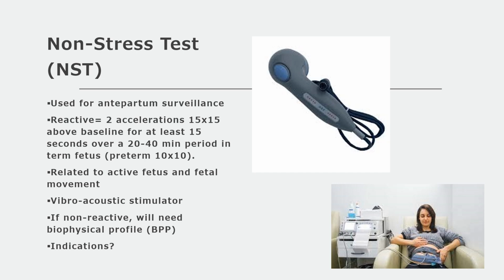Okay, this is an ultrasound test that measures amniotic fluid index, heart rate, breathing, gross body movement, and fine body movement. So there's 5 criteria. They either get a 2 or a 0. Usually if they're over a 6, that's a good biophysical. If they're under 6, then they may consider delivering the baby depending on gestational age.